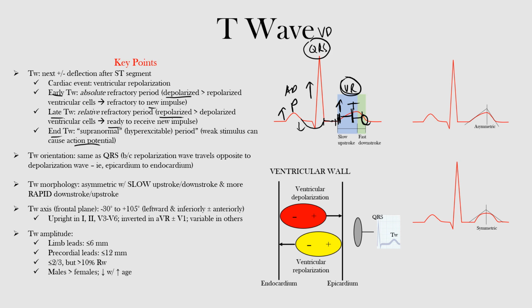Now, during ventricular depolarization, the impulse moves from the endocardium to the epicardium, leaving the subepicardium positively charged. Therefore, the subepicardial area appears positively charged to the electrode and will show up as a positive QRS deflection. Okay? So if you look here, this is our ventricular wall, where this is the endocardium, the inner layer, the epicardium, and notice that our depolarization wave is moving from left to right, and here's our positive end. This right here is our electrode, okay? And what that electrode sees is this positive end. And because of that, we have our QRS complex that is going up, okay?